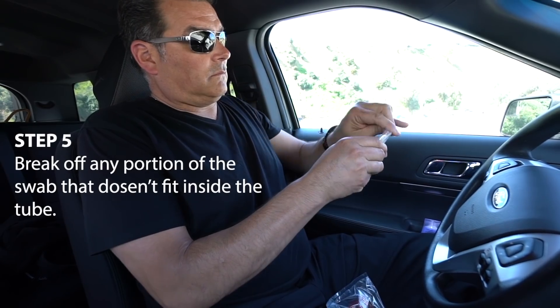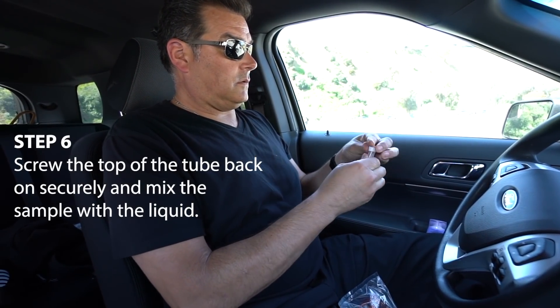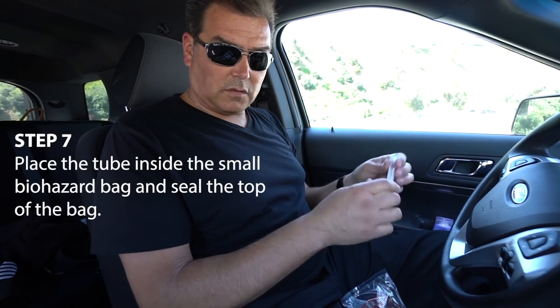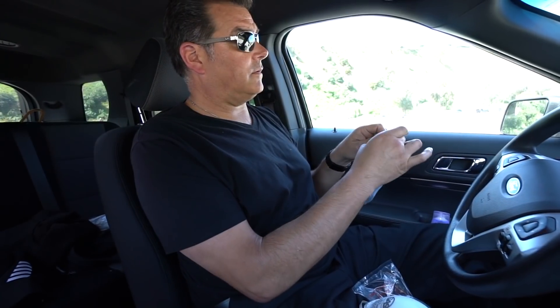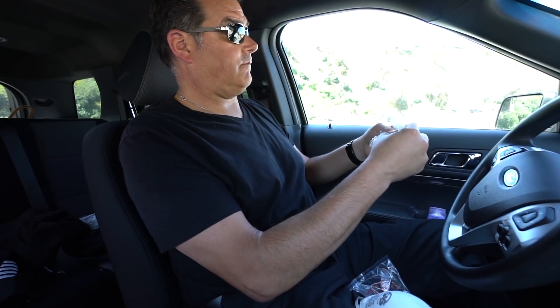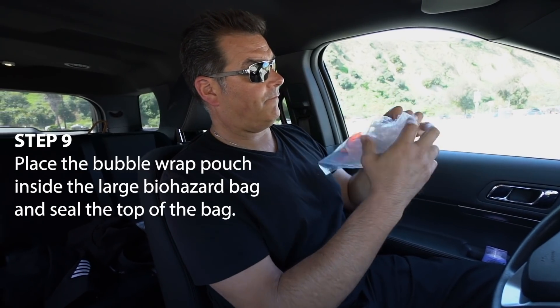Step 5: Break off any portion of the swab that doesn't fit inside of the tube. Step 6: Screw the top of the tube back on securely and mix the sample with the liquid. Step 7: Place the tube inside the small biohazard bag and seal the top of the bag. Step 8: Place the biohazard bag inside the bubble wrap pouch, roll to remove air, and seal.